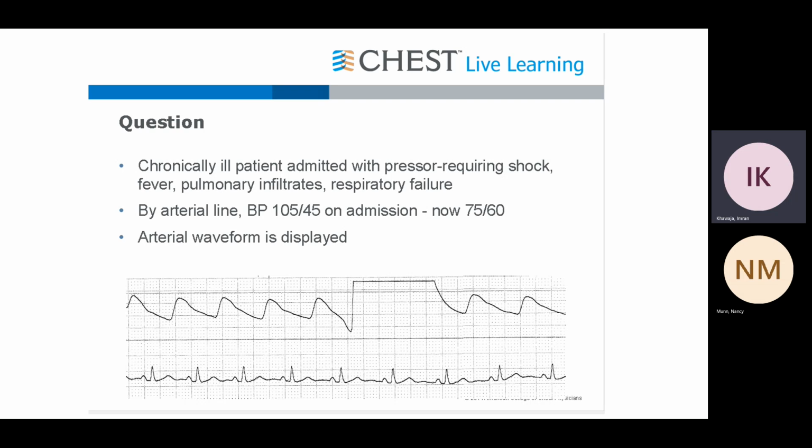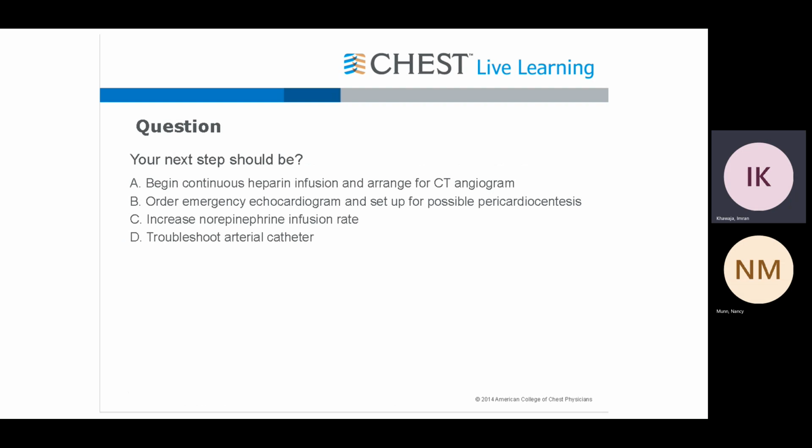So is the MAP lower or higher than normal here, Eunice? What do you think? MAP shouldn't change. Awesome, good. MAP is preserved, right? But nonetheless, you have to troubleshoot. So what do you do here?